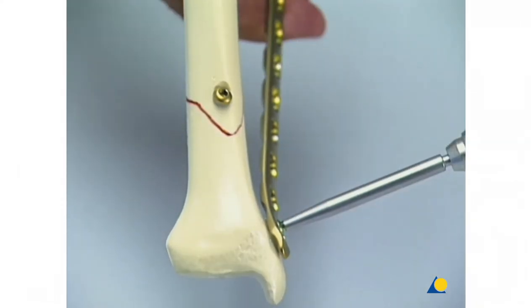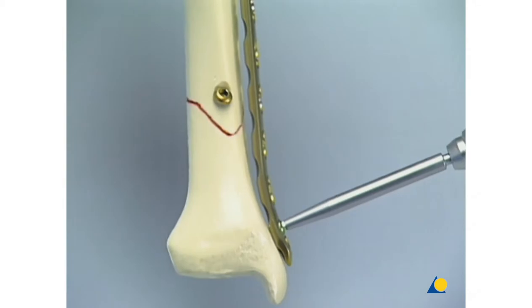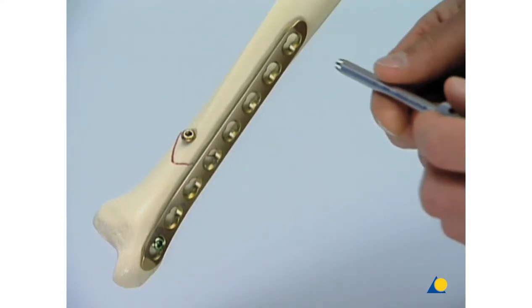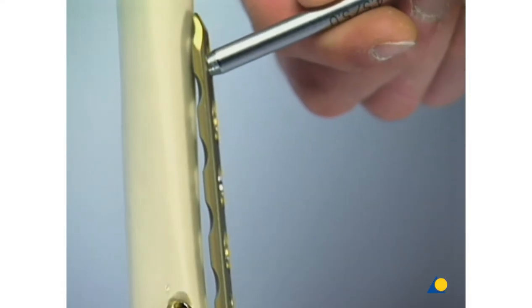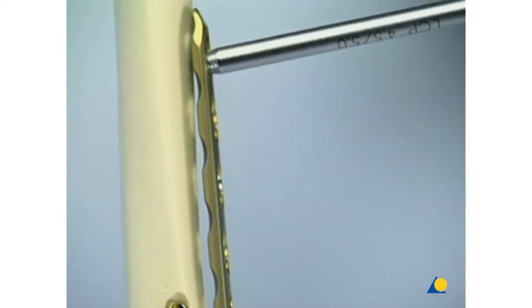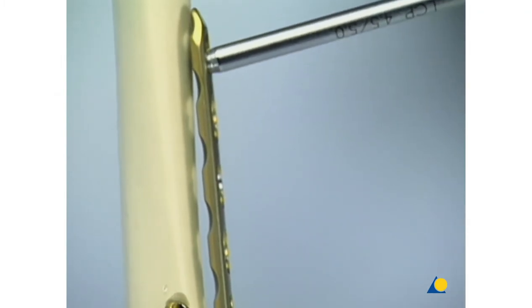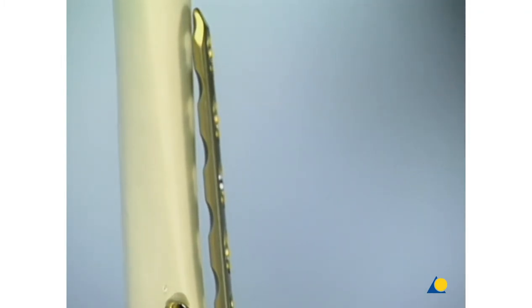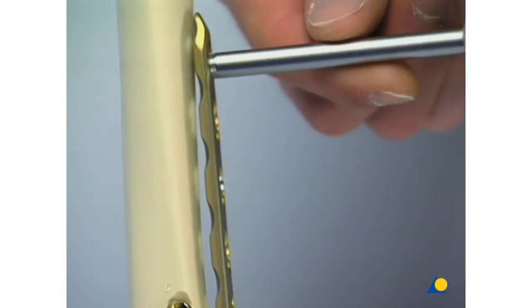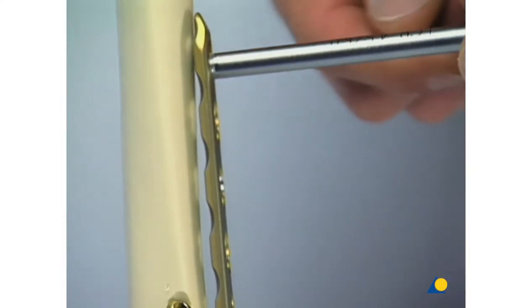Therefore, before completely tightening the first screw, the plate is fixed to the bone using the most proximal screw hole. The LCP drill sleeve is gently screwed into the threaded part of the combination hole. To make sure that the sleeve has been placed correctly, its purchase in the screw hole has to be checked. Here, it is moved sideways, which means that it has to be reinserted. Once the thread has found a firm hold in the plate, the sleeve will not move.